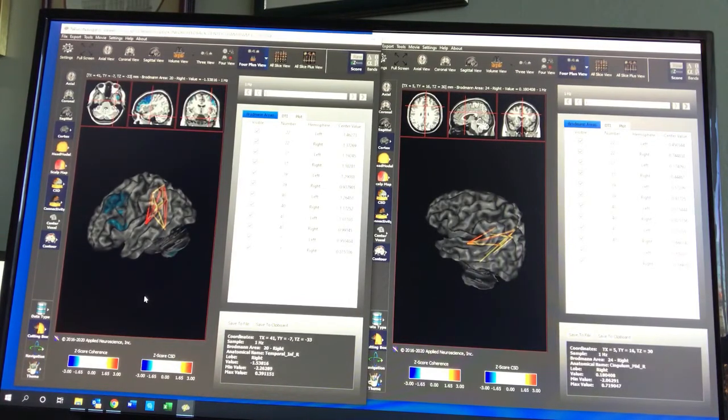Okay, here we are again. My name is Dr. Pamela Bell at the Advanced Neurofeedback Center here in Dallas, and I'm going to present a case of a person that lost their ability to speak. The described diagnosis was aphasia, transcortical sensory posterior aphasia is what we diagnosed. And I want to first show you the image on the left because it describes the baseline of this patient.